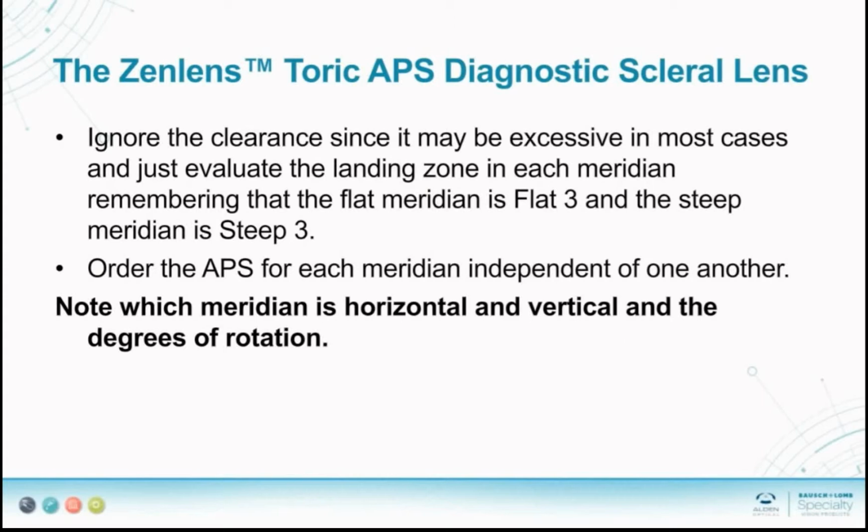If you are confused, document the rotation of the lens and determine if that meridian needs to be ordered flatter or steeper, and then look at the opposite meridian and determine if that needs adjustment. When in doubt, the consultation team is happy to help you. Make sure you are clear which meridian is closest to the horizontal and vertical to allow for proper marking of the ordered lens.